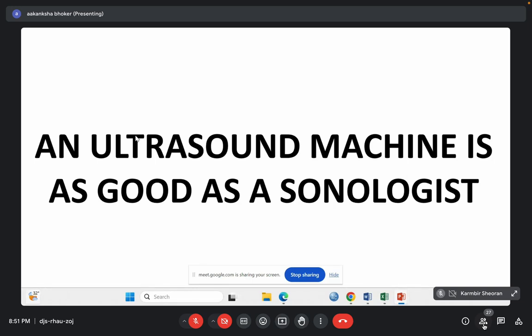suppose in humans also, then there is a possibility that these stones can simply be flushed out. But how can we know? Only when the lateral resolution is good. But if our lateral resolution is not good, it will look like these are not two small stones but one big stone. So at that time the chances of flushing are less and maybe we have to surgically intervene.